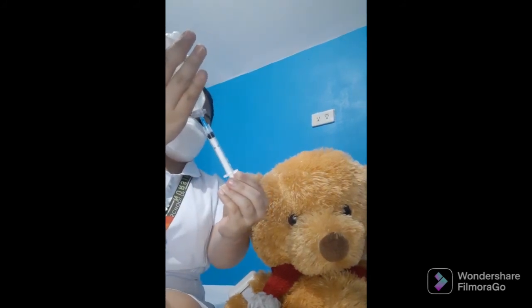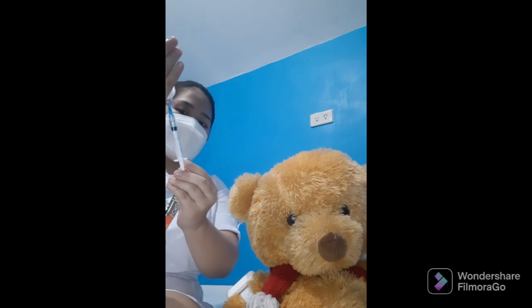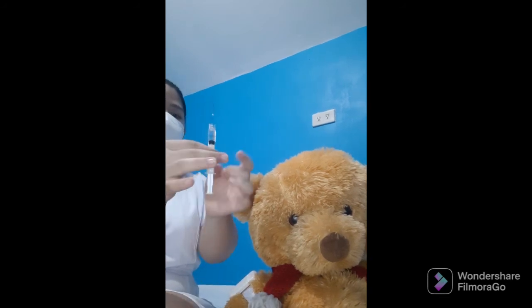1 ml. So, check po natin kung nagana po yung ating syringe. And then, 1 ml. So, pag may bubbles po, pwede naman po natin ibalik. And then, mag-withdraw lang po tayo ng 1 ml. And we need to tap para mawala po yung mga bubbles. Okay. So, 1 ml na po.